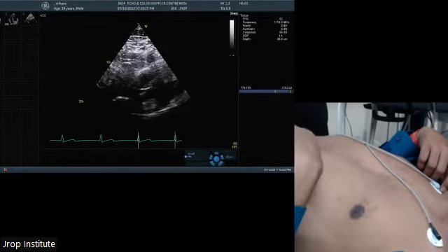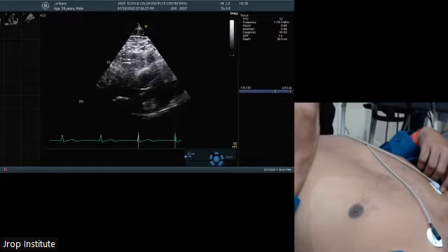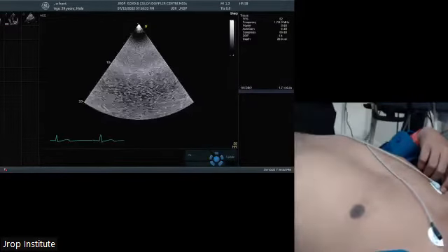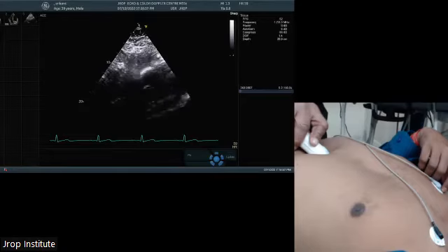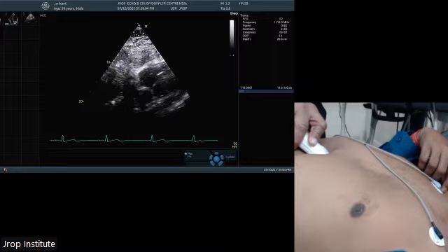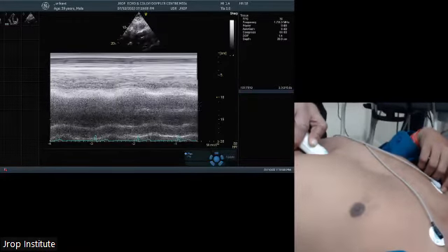Thank you, sir. Okay, right. Rupali: Sir, how to change it to M mode, sir? There's a button, press M mode, M mode will come automatically. Just a minute, Rupali. Sir, how to take the right parasternal? I'll show you, Rupali, just give me 2 minutes.